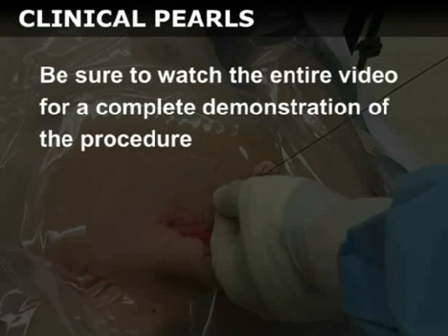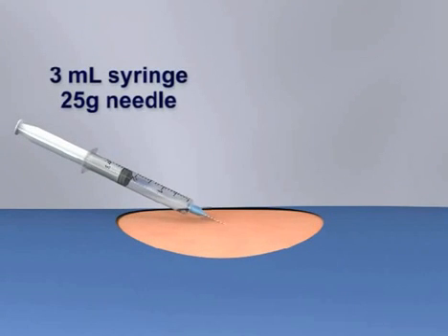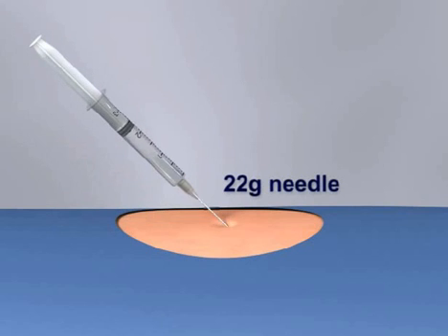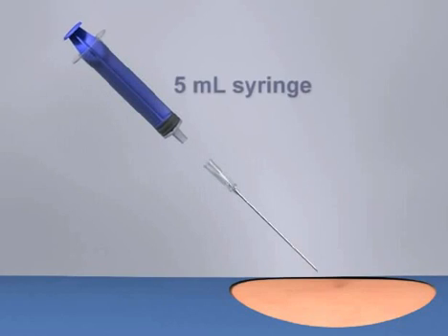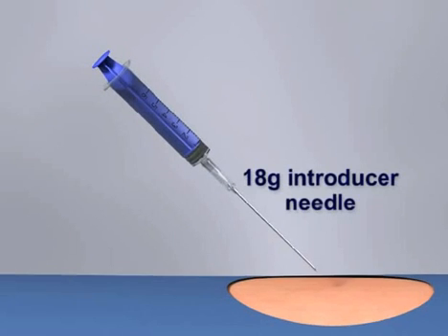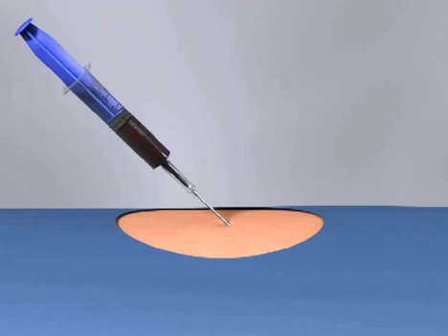Be sure to watch the entire video for a complete demonstration of the procedure. Use the 3 mL syringe and the 25 gauge 1 inch needle to place a wheal of anesthetic in the skin. Switch to the 22 gauge 1½ inch needle to place anesthetic into the deeper tissues. Next, attach a 5 mL syringe to the 18 gauge 2½ inch introducer needle and advance toward the vessel. Pull back on the plunger as you proceed. Blood will fill the syringe when the vessel is entered.